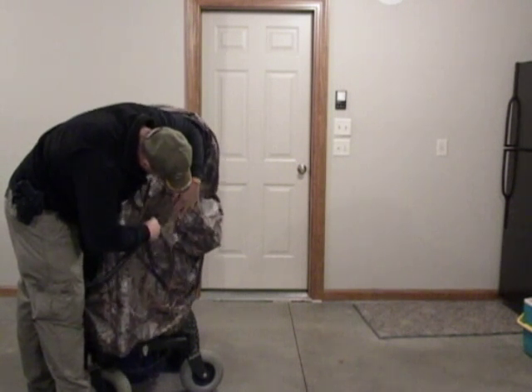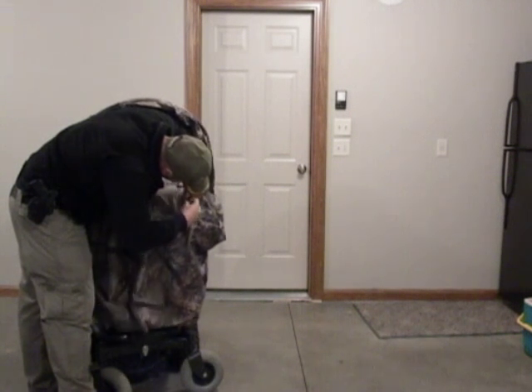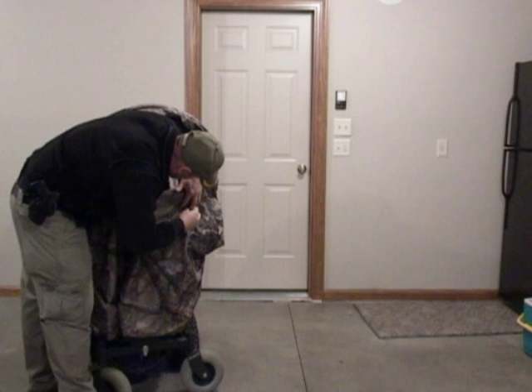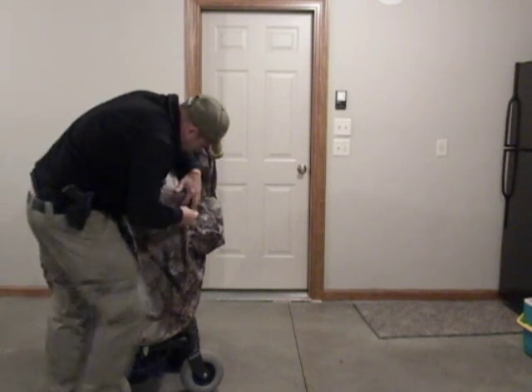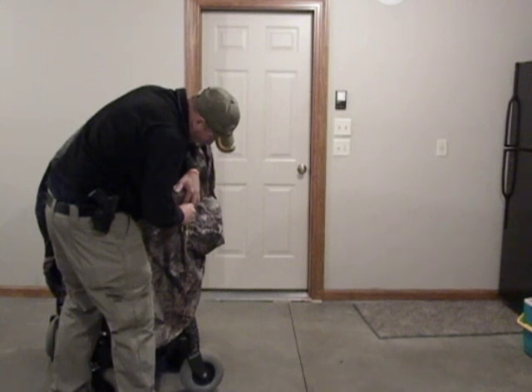So we'll put the handles back in place just in case he does get stuck. The other thing that does is keeps the blind, when he lifts it up over his head, from coming too far over.